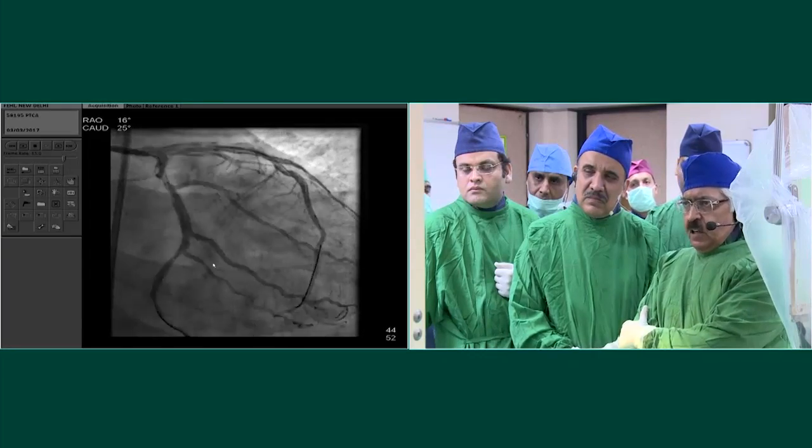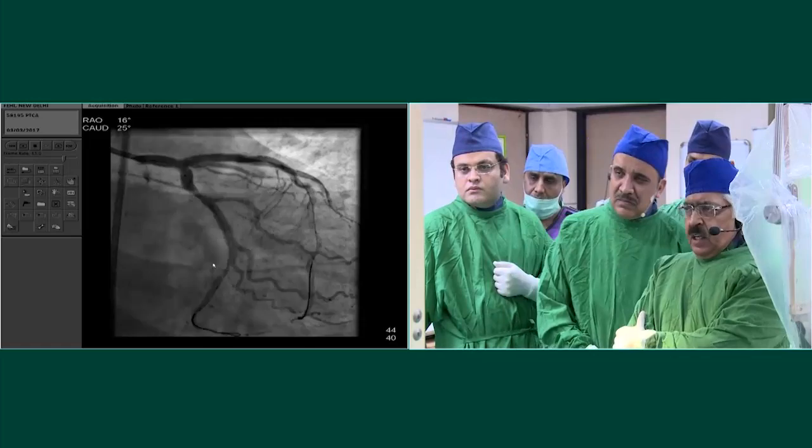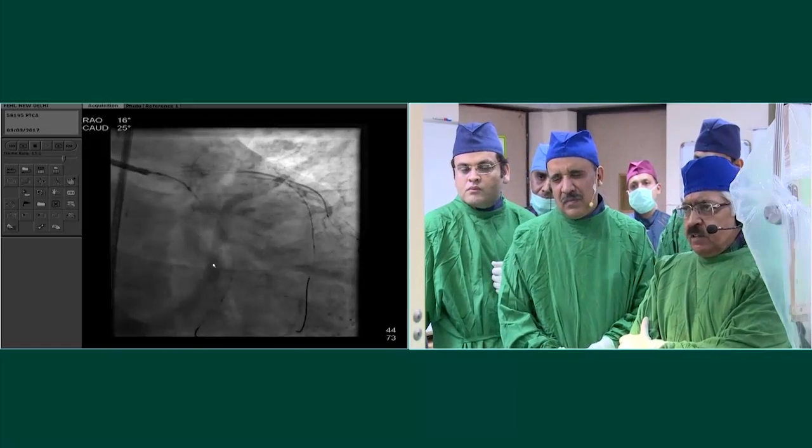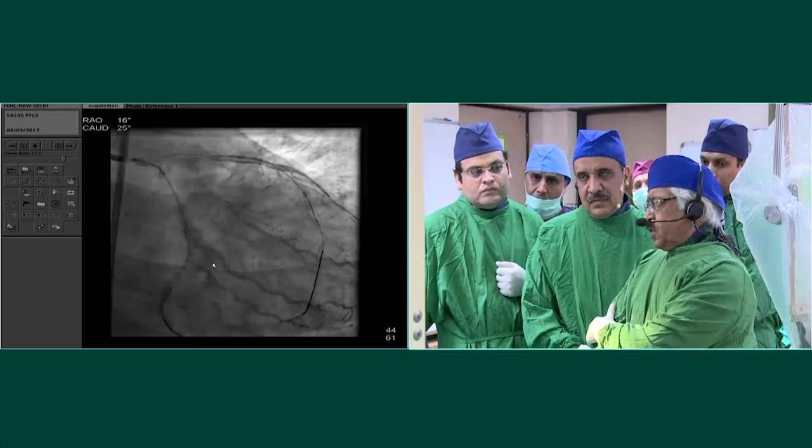I have patency of the circumflex, a patency of the diagonal. I'm looking okay. I seem to have covered the ostia, but I think I'm a couple of millimeters proximal.